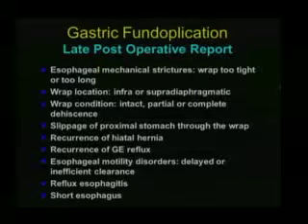If there is recurrence of the hiatal hernia, since this is an anti-reflux therapy, we have to mention in the report if there is recurrence of the reflux and the complications like reflux esophagitis. We have to mention additionally if there are esophageal motility disorders, okay?